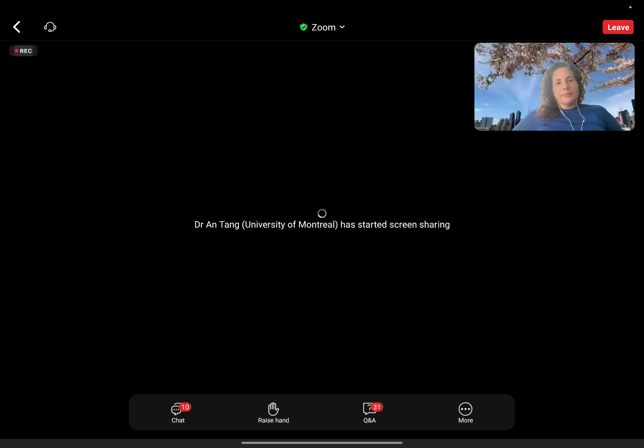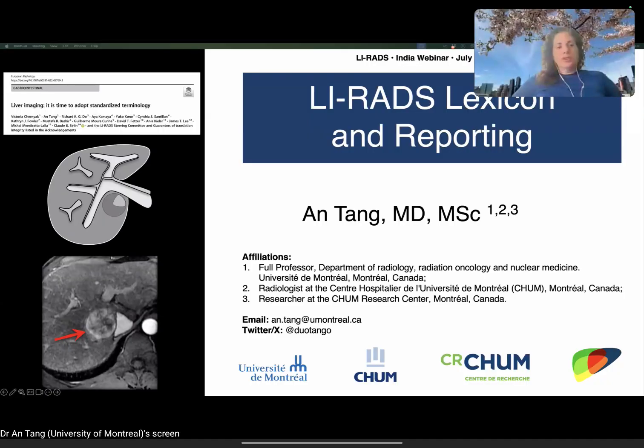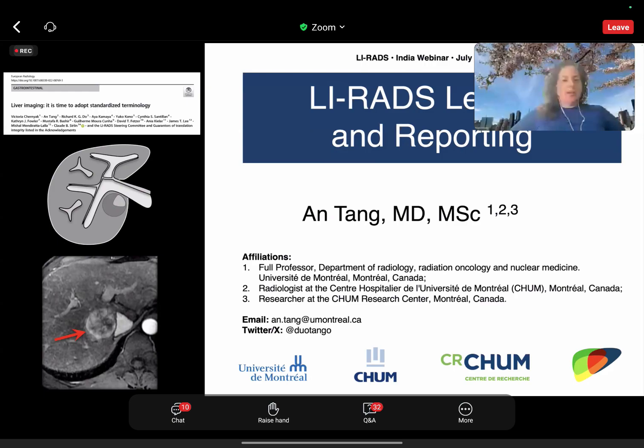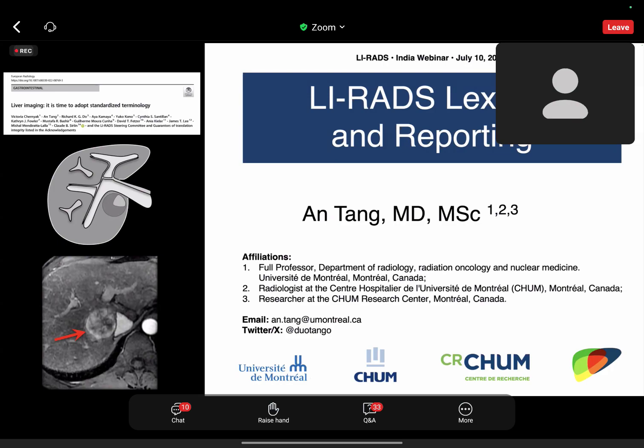They're excellent questions. I just want to remind people that LI-RADS is evolving, right? We want everyone to use it. Currently it mostly favors the extracellular contrast agents, although we have ancillary features to address people who are using the hepatobiliary type contrast, so we do have some caveats for that. LI-RADS will have to evolve if we move to more non-contrast abbreviated protocols. We understand that, and LI-RADS is evolving. Your questions are awesome because we will try to incorporate them as LI-RADS grows and evolves, just as our field is evolving.